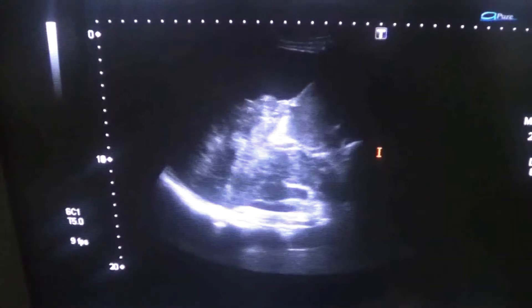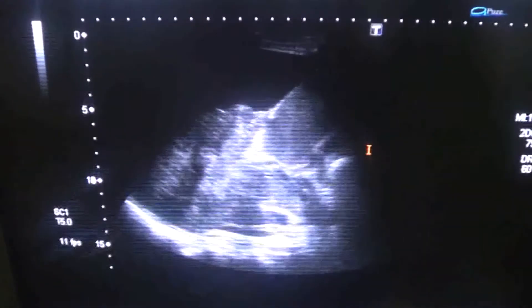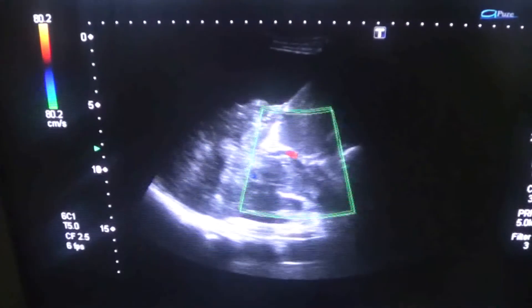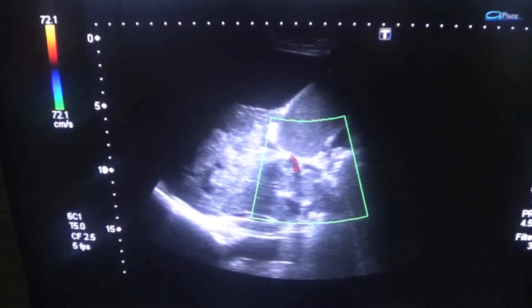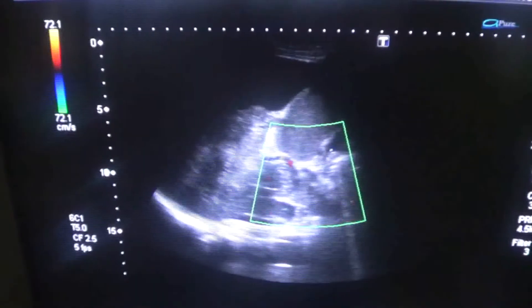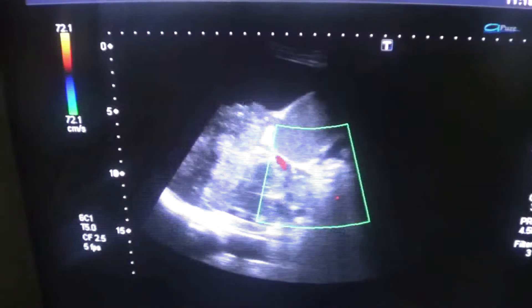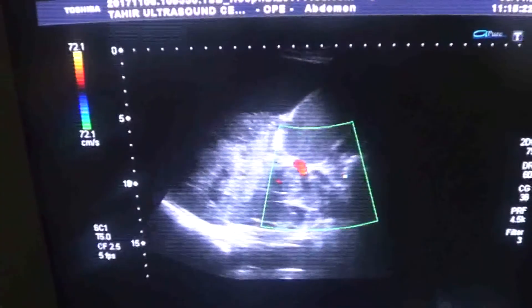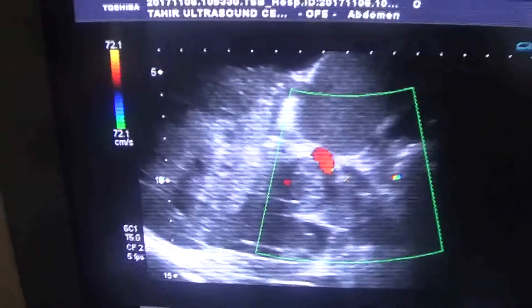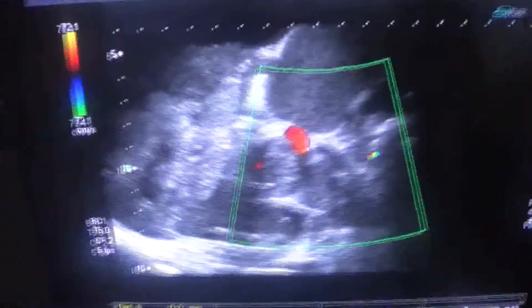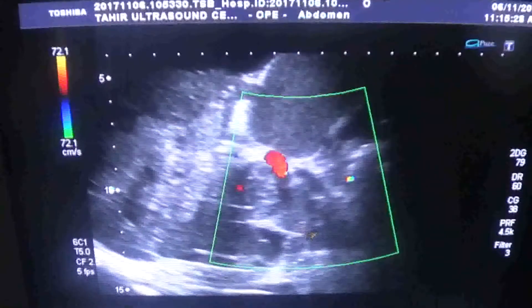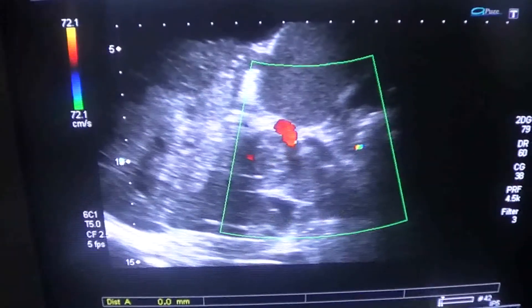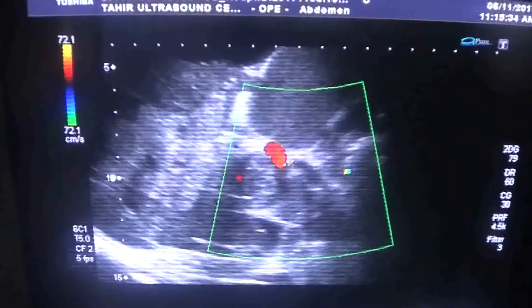Now this is the gallbladder. This is the portal vein, which shows clot, and along with that there is no flow seen within the portal vein. The portal vein is dilated. This area is the portal vein. This is the echogenic posterior wall, the anterior wall, and this is the clot within the dilated portal vein.